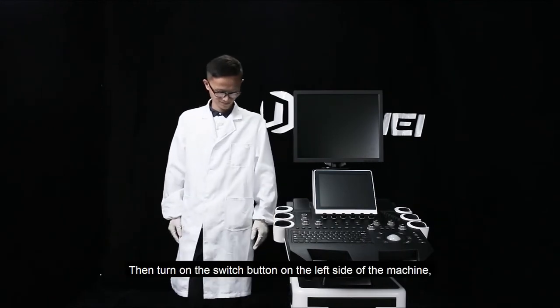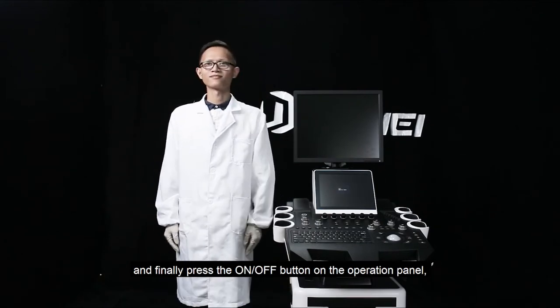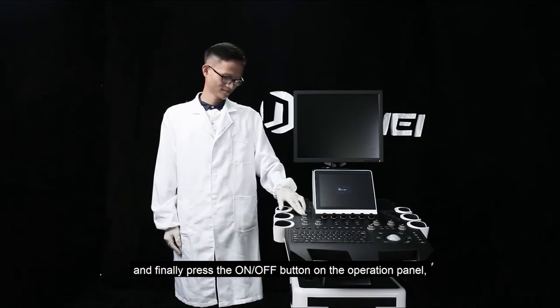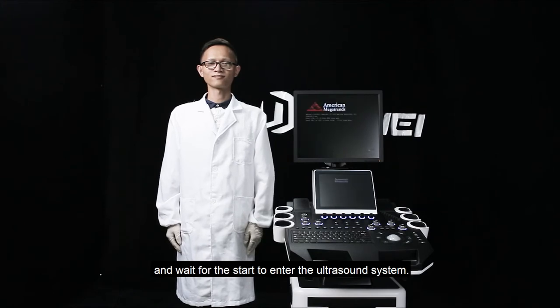Then, turn on the switch button on the left side of the machine. And finally, press the on and off button on the operation panel. And wait for start to enter the ultrasound system.